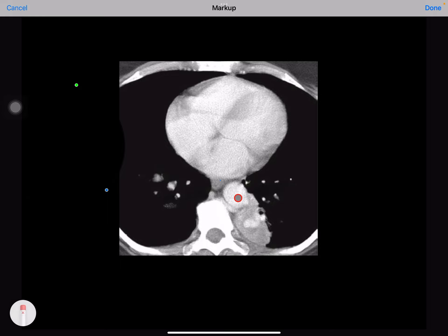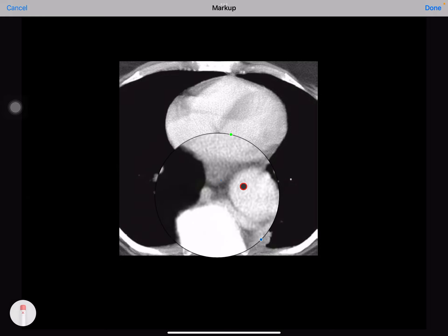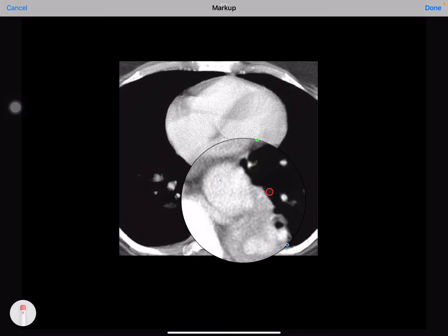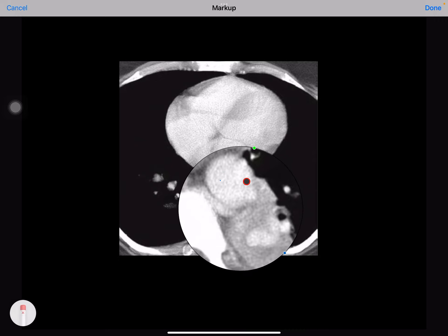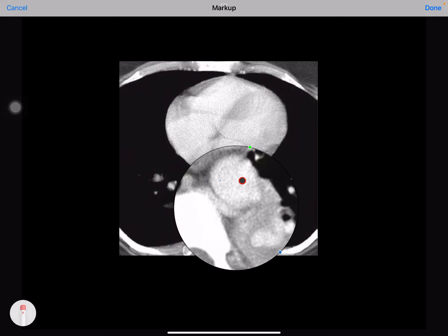If you magnify this, you can see that this is the artery that is arising from the descending aorta. You can also appreciate that there is a drainage vein.